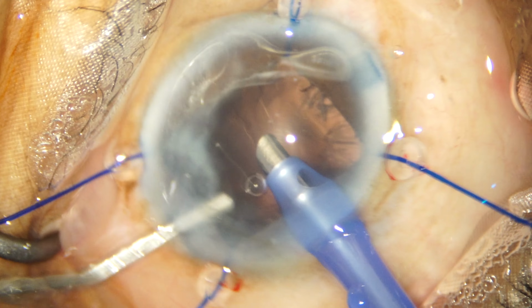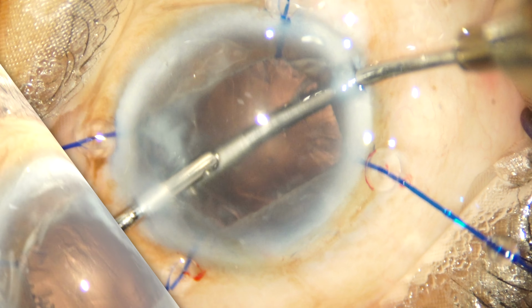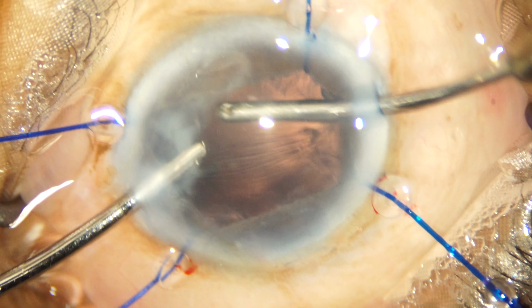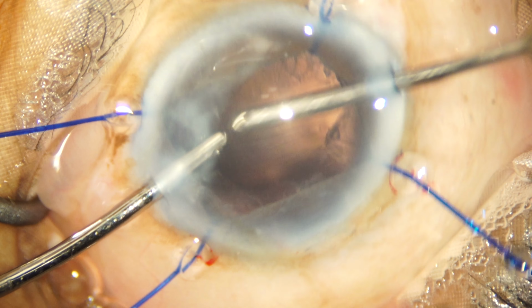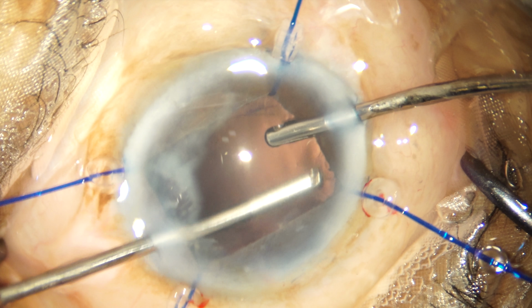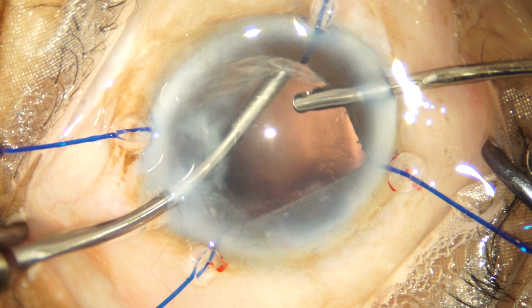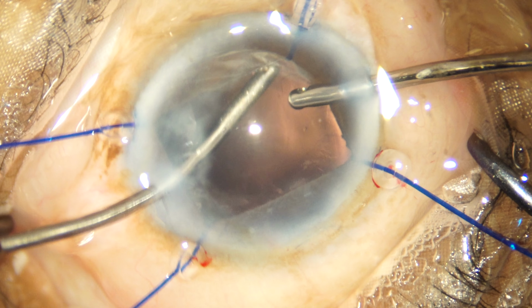So now that most of the nucleus is out, we go ahead with the irrigation aspiration. My preferred technique always is the bimanual irrigation aspiration for removing the cortex. Pseudoexfoliation cases are very prone to zonular dialysis because of the weakened zonules. So we should be very careful that when we're aspirating the cortex, we should not grasp the capsular edge or part of the capsular bag.